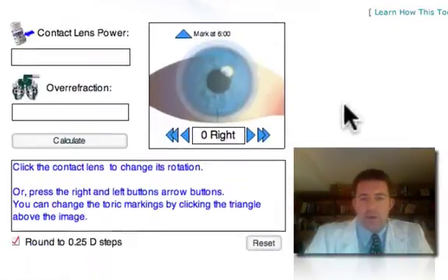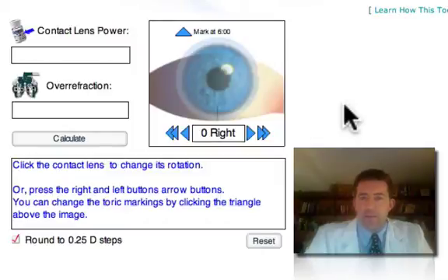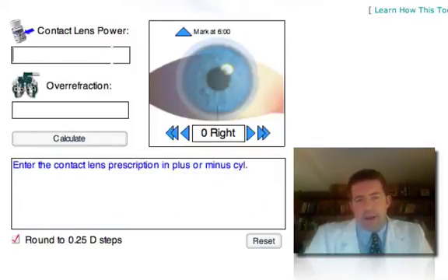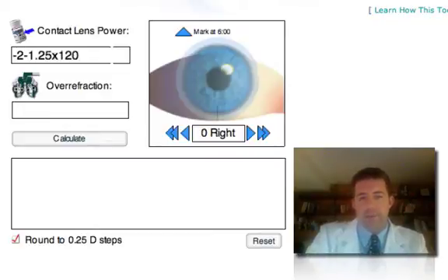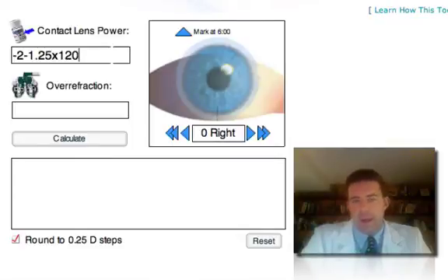And I try to make this tool about as easy as it possibly can be. The first box here is for contact lens power. So let's say we have a lens that is a minus 2, minus 1.25 axis, let's say 120. You can type the prescription in any format that you want, as long as it has a sphere power, a cylinder power with a sign. In most contexts, of course, it will be a minus cylinder power, and then an axis between 0 and 180 degrees.